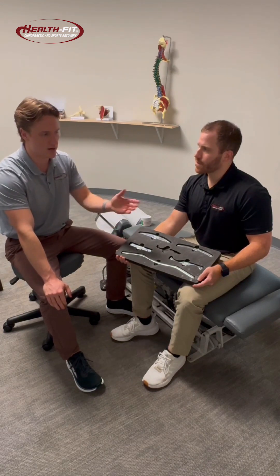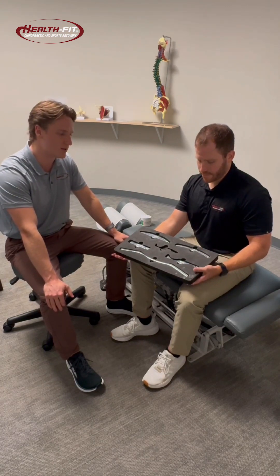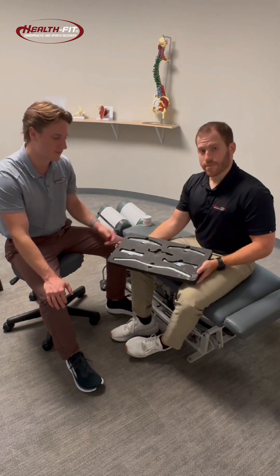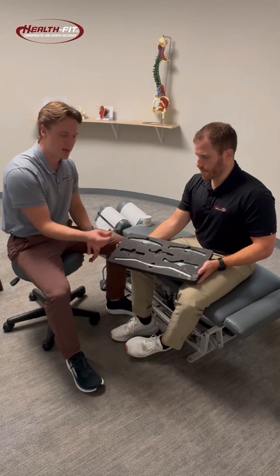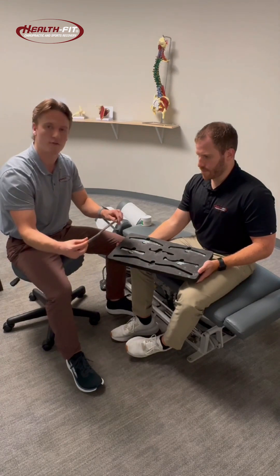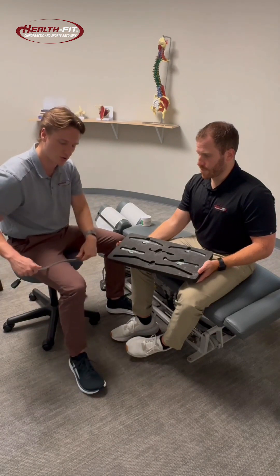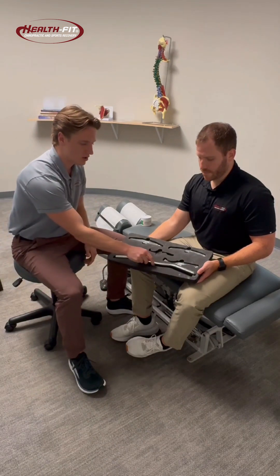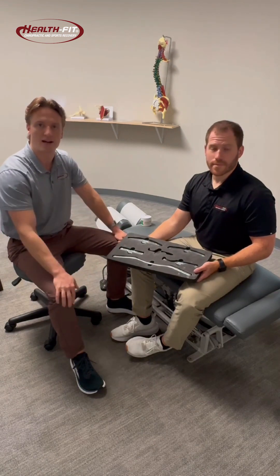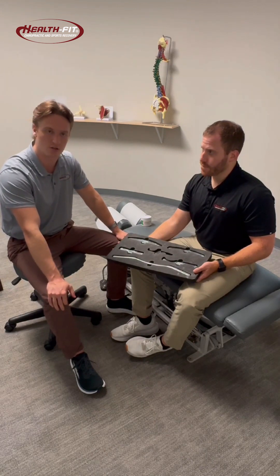Today I'm going to demonstrate on Matthew's elbow what treatment looks like in practice. We have a variety of tools, as you can see — all sorts of different shapes and sizes, and they all have practical uses. A great big tool like this can often work on the upper traps or maybe the hamstrings or quads. We have smaller tools as well, all angled differently to help the practitioner be efficient with the tool and get to the tissues we need to reach.